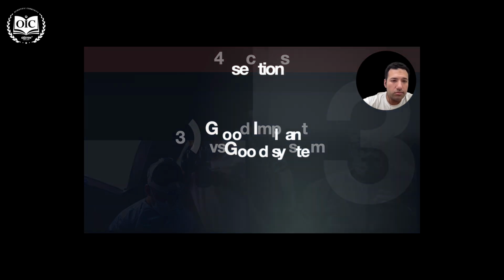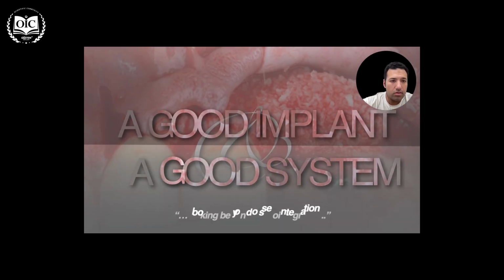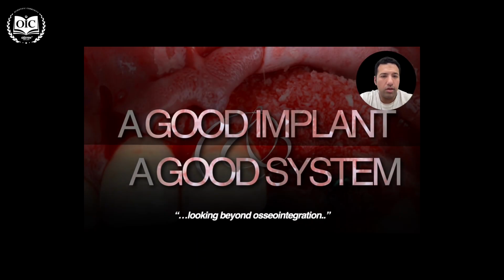Actually, I can see many good implants in the market, and I can see many good implants on x-rays with 20 years follow-up and 15 years follow-up that has minimal bone loss, but unfortunately success is not just only survival. We have many factors to think about.